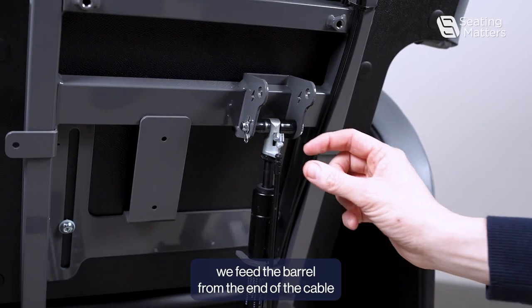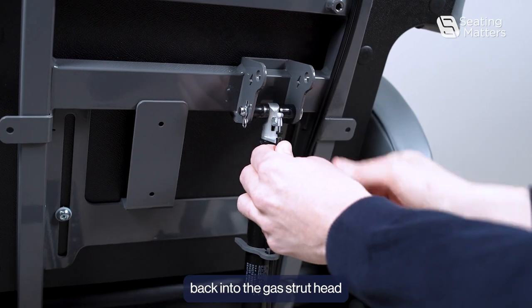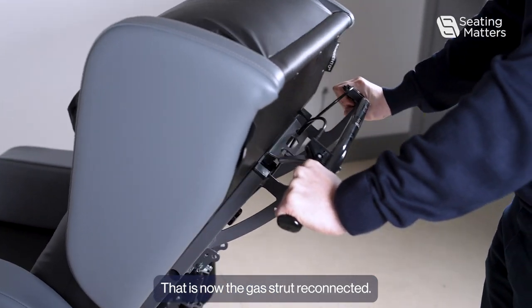To reconnect it, we feed the barrel from the end of the cable back into the gas strut head and clip it back in. That is now the gas strut reconnected.